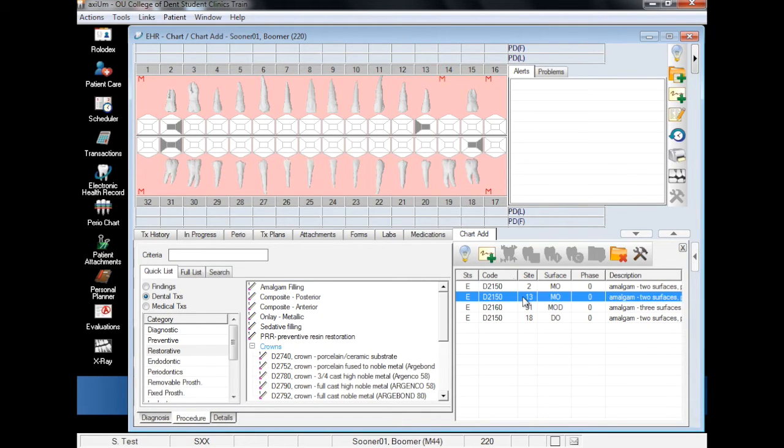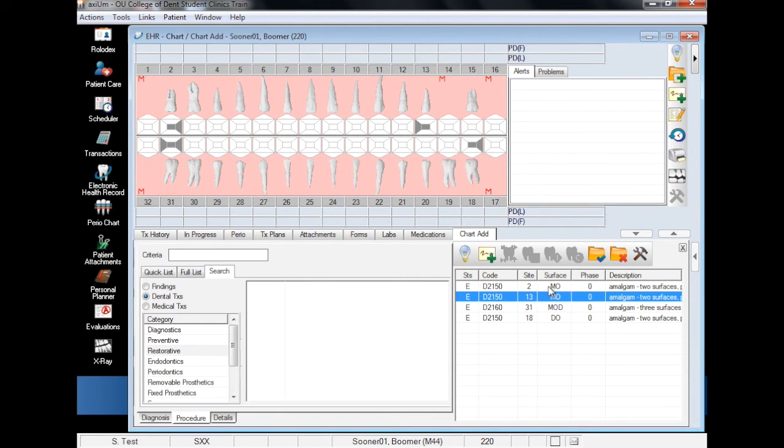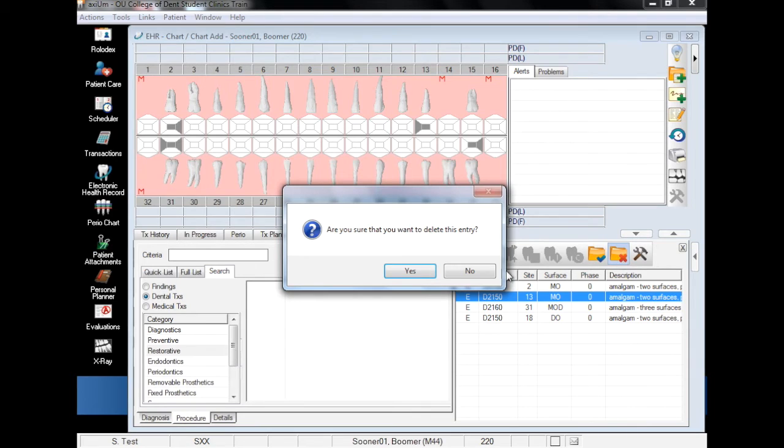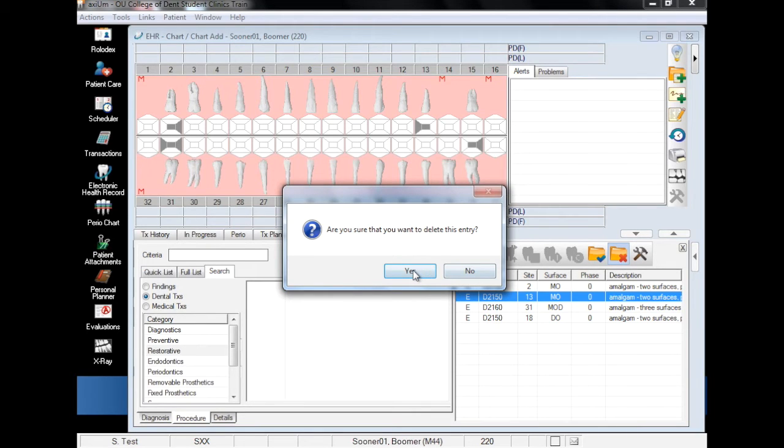If a tooth has been added in error, you can simply select the tooth from the findings list and click the folder with the red X. The tooth will be removed from the list and the restorations will be removed from the Odontogram.